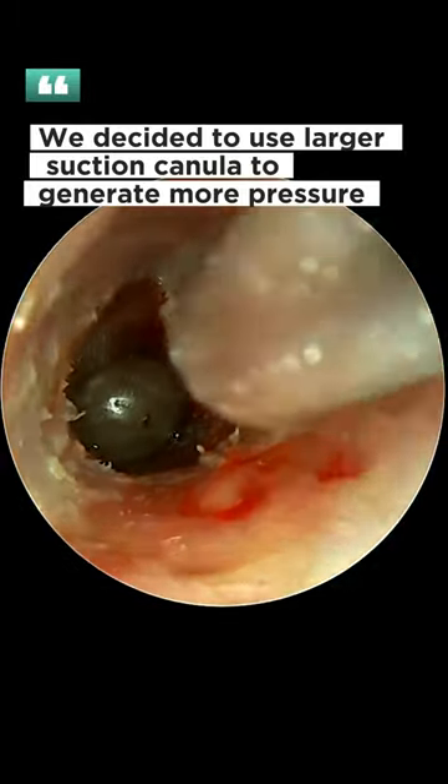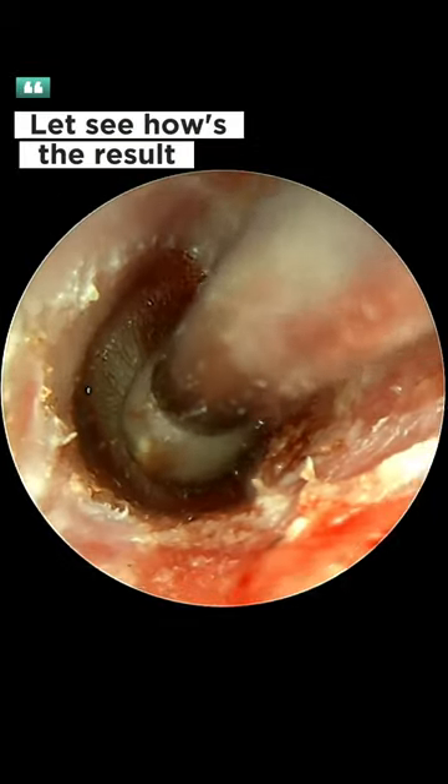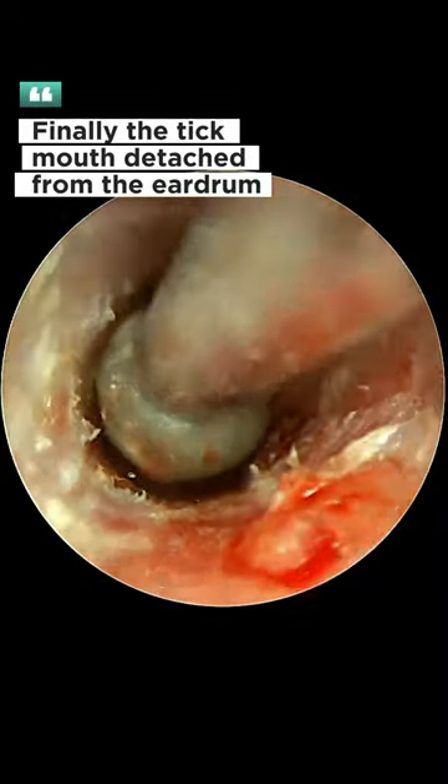We decided to use a larger suction cannula to generate more pressure. Let's see how's the result. Finally, the tick's mouth detached from the eardrum.